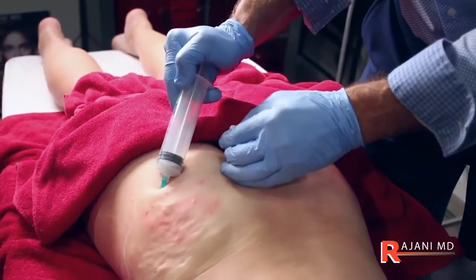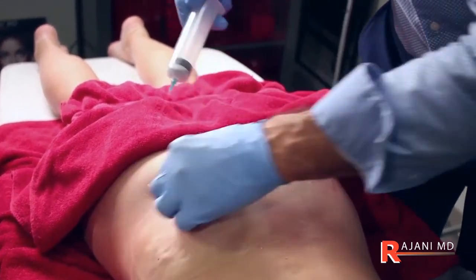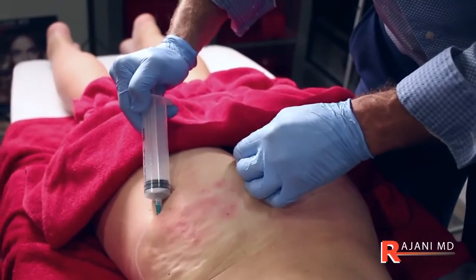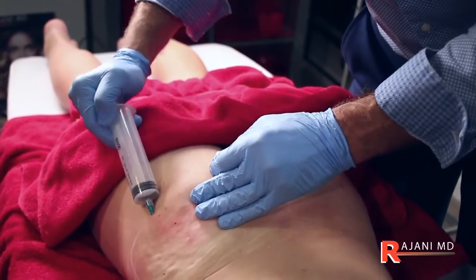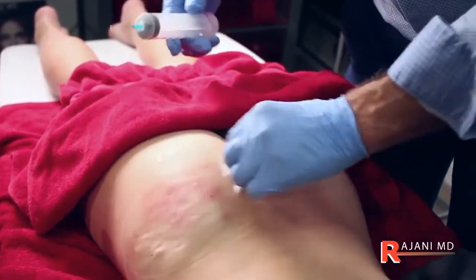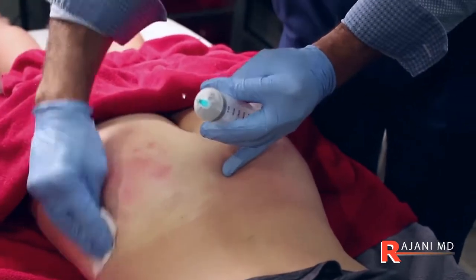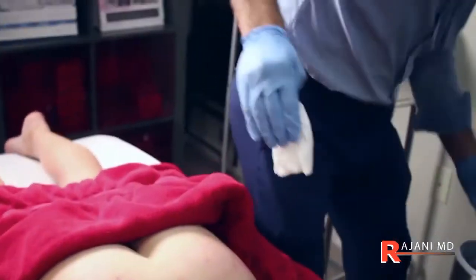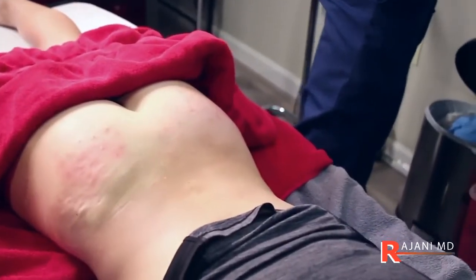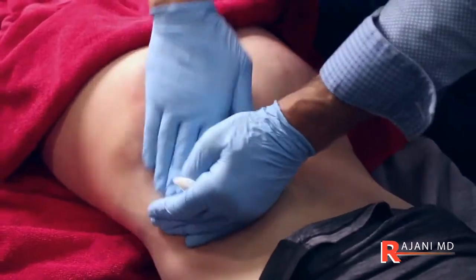So keep asking questions. I know when I go around the country and I train, this is one of the most requested procedures. Of course, this is an off-label use of Sculptra, so it's not something that a lot of people get trained on. So there we go. There's 60 mLs or 60 cc's. Now, I use an arnica massage. These things hardly fit into your sharps container, okay? They're big syringes.